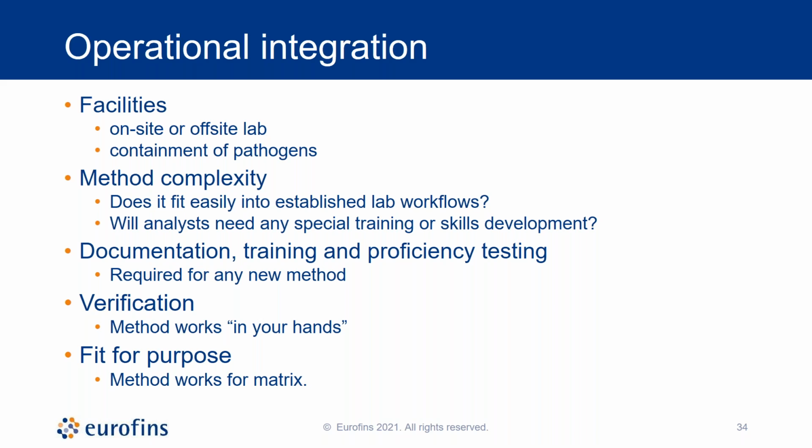If you're already running one platform, you'll probably find training on the method is very easy to switch to a new platform. Any method that we bring on board and start to run, of course, will need some documentation. We do need training. We do want proficiency testing. That's really not a differentiator in any sense because all methods have that requirement.